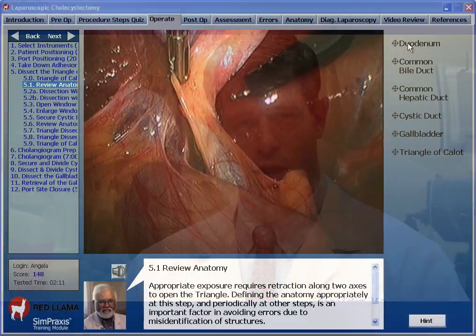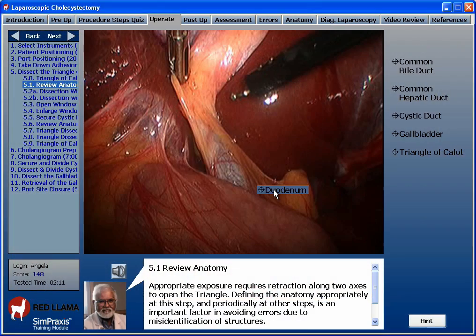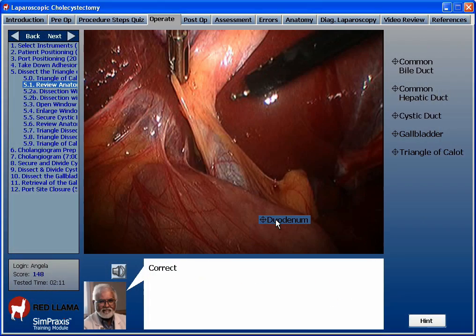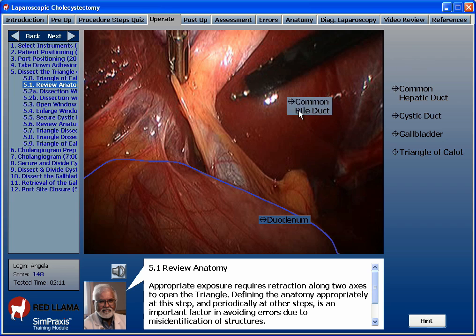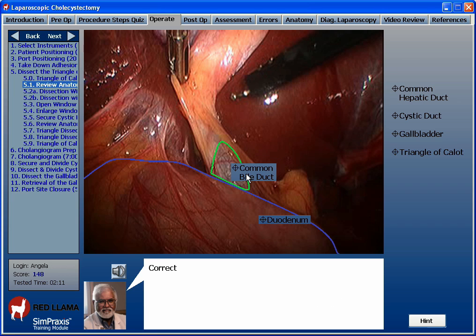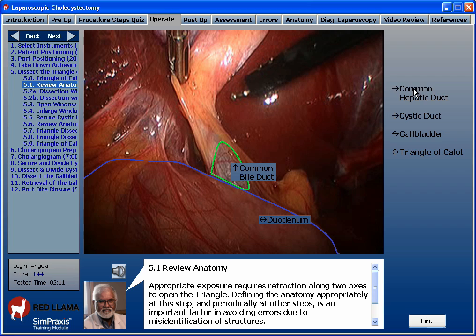Anatomy and the risks of error, injury, or complications are reviewed during each step and phase of the procedure. You will interactively review the key anatomic structures at appropriate steps. You will receive constructive mentoring — visual, verbal, and written — each time you make an anatomy error.